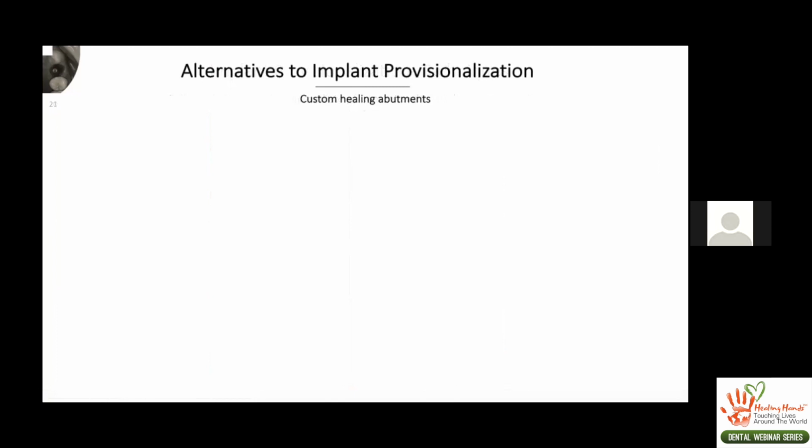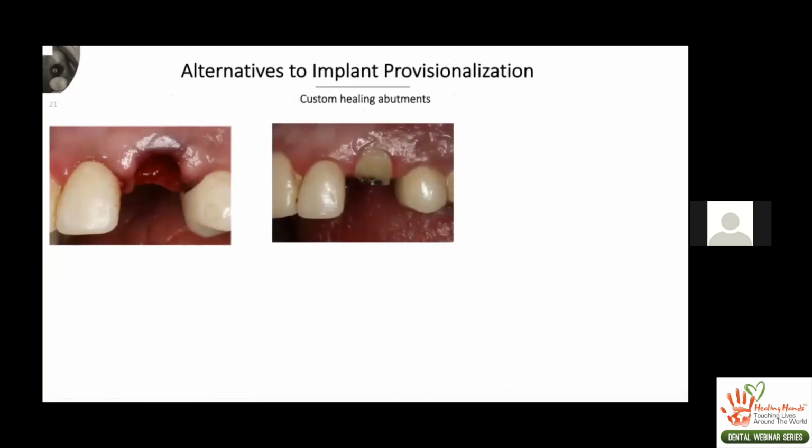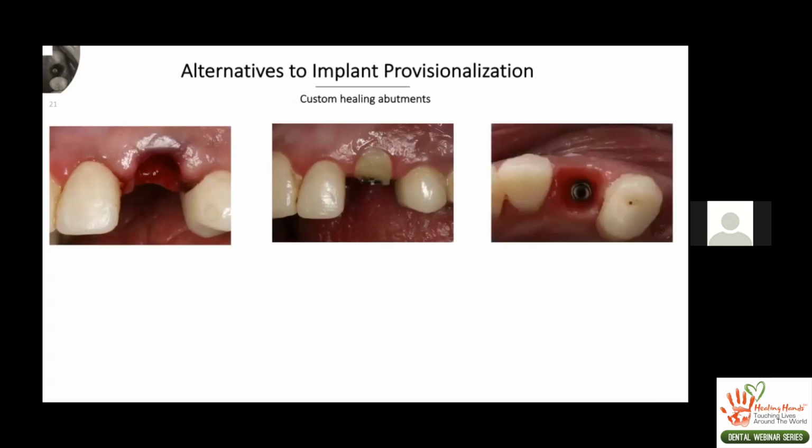So if you're not able to do that, there can be several scenarios. Let's say your implant doesn't have the stability, or the occlusal factors really prevent you from being able to place an immediate provisional on the same day. What you can consider is what's called a custom healing abutment in an extraction socket. This is something that you can keep modifying. Use a similar temporary abutment or a custom abutment, and basically use a resin material to develop the soft tissue that you desire. And the benefit of this also is that once your soft tissues are matured and after your initial osseointegration phase, you can always modify your custom abutment, the critical and subcritical contours, to get to the correct emergence profile that you are trying to develop.